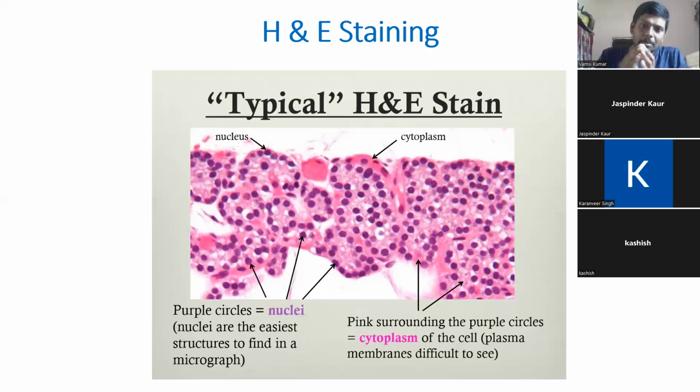So now I'm going to use antibodies, and I'm using a specialized fixation technique that won't damage the cells and tissues, so that I can identify or visualize the specific proteins that I want in the tissue. That technique and that field is called immunohistochemistry, and that is our subject.